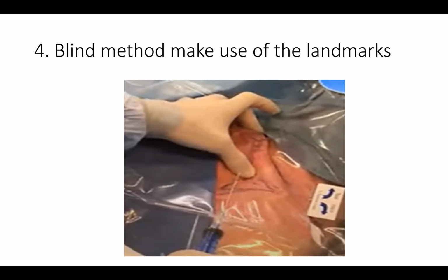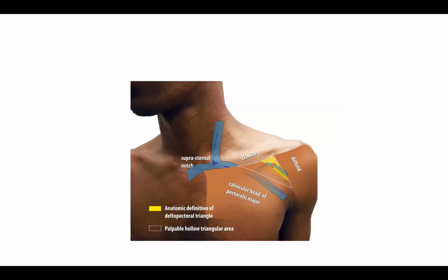Why we take a little time to describe it is that this is the most common method being used in sub-Saharan Africa. It is not only cardiologists that implant devices. The surgeons implant devices. Most of the time when the surgeons implant, they use more of either the cephalic or the axillary vein. But most of the time when the cardiologists implant, they use more of either the axillary or the extrathoracic subclavian vein. So this is how the variations are. And since I've been doing it, I've not had anyone with hematoma or pneumothorax.